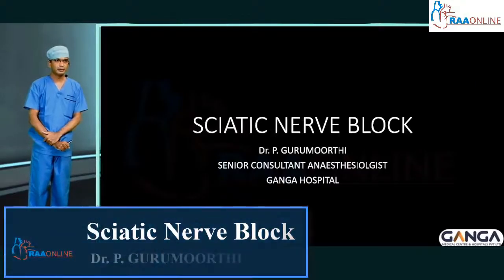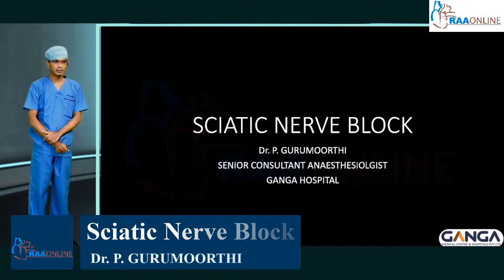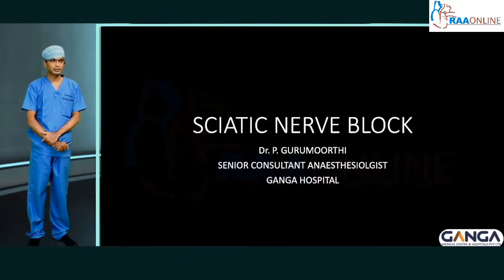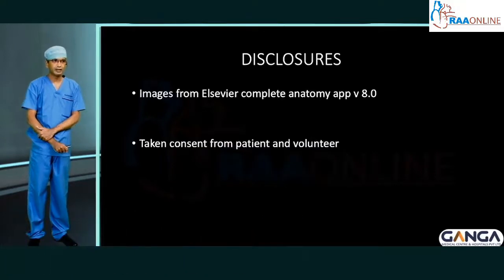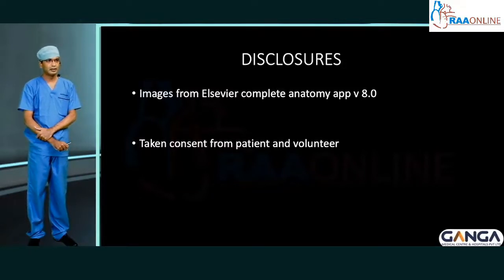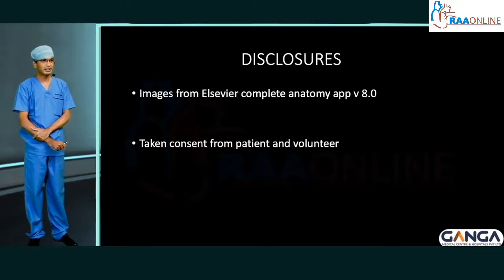I am going to talk about sciatic nerve block, especially three approaches: subgluteal approach, then popliteal approach, followed by anterior sciatic approach. I have taken some of the pictures from Elsevier Anatomy app. Also, I have taken consent from patient and volunteer.